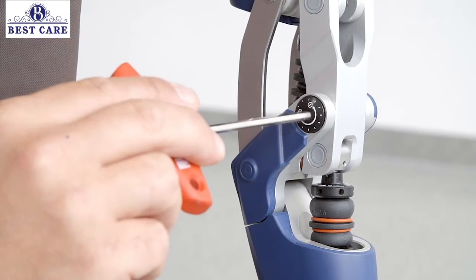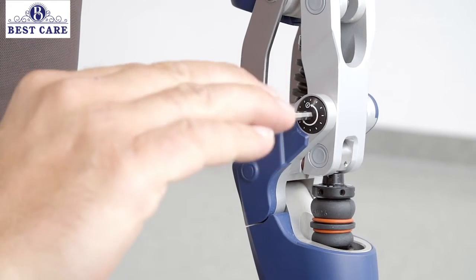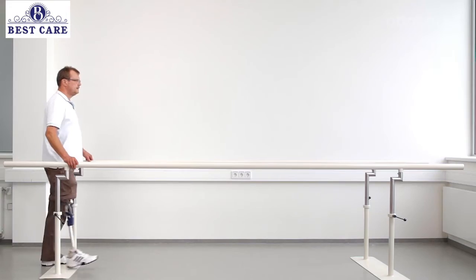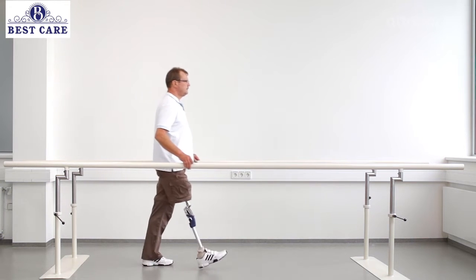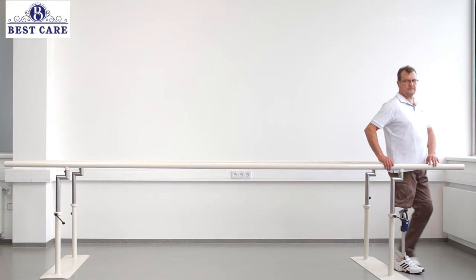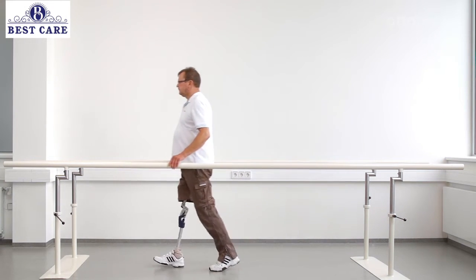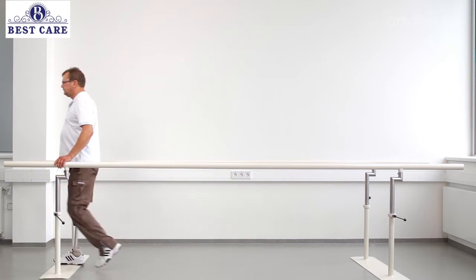When adjusting the swing phase, remember that the extension assist and swing phase friction influence each other. Please ensure that swing phase friction is increased only in small increments. Otherwise, the knee joint may not reach full extension due to high friction at the axis, and heel strike will occur with a flexed knee. This can be an unsafe situation for the user.